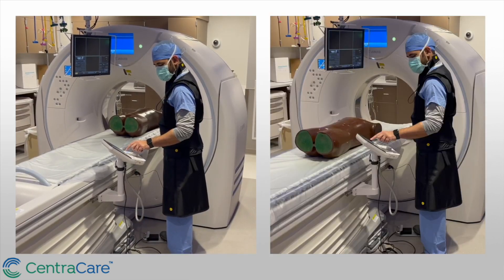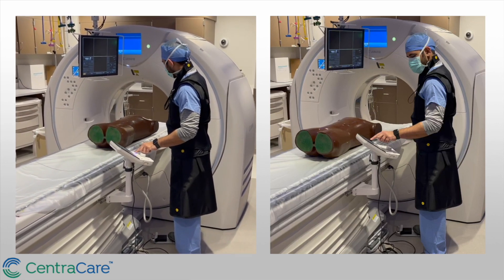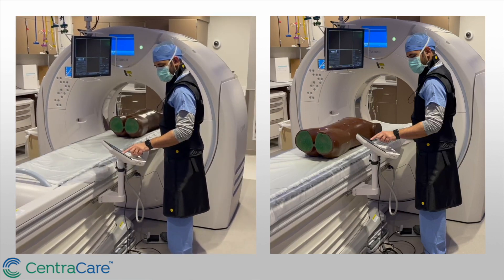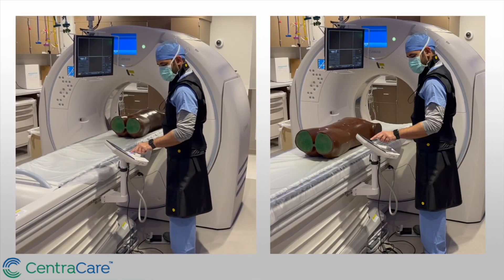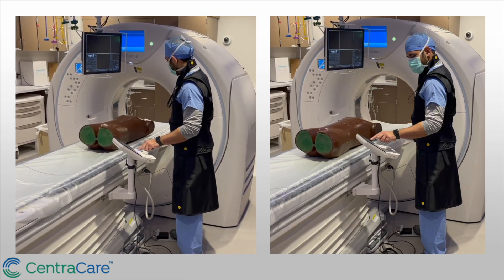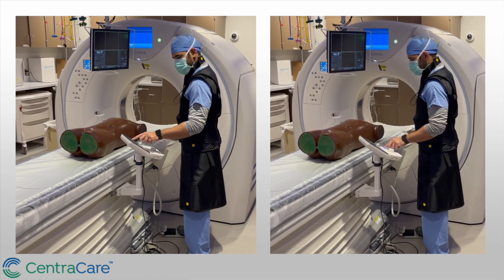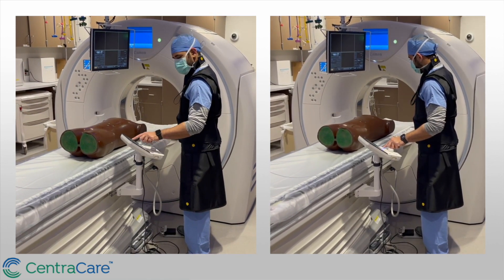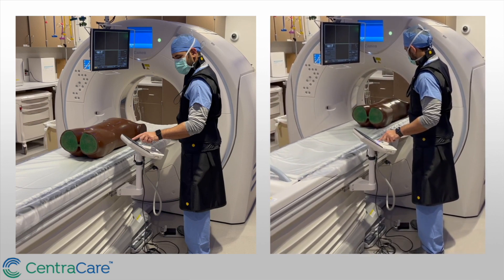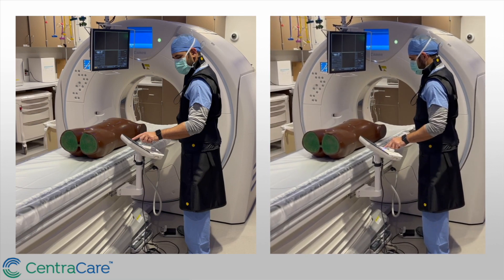I will be discussing the functions of the touch panel and briefly describing how I use the interface and how this system helps me during basic CT-guided procedures like biopsy, drain placement, ablations, etc. I am standing in the CT room right next to the CT couch, using the CT fluoro interface panel. As the couch moves out, I can stop the couch exactly where I'm standing so the patient is right in front of me.